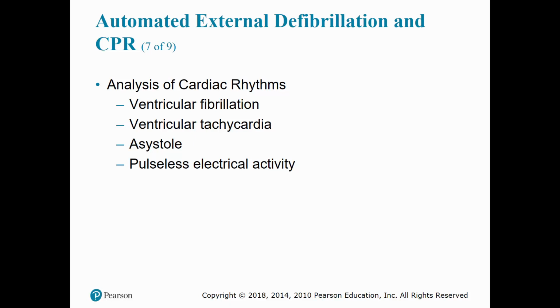Said it earlier, read your patient and not your equipment, because you may see an electrical rhythm but there is no mechanical pulse behind it, meaning you didn't check a pulse. The patient's heart is not beating, but it appears on the cardiac monitor. So always look at the patient as well as your equipment, and not just your equipment.